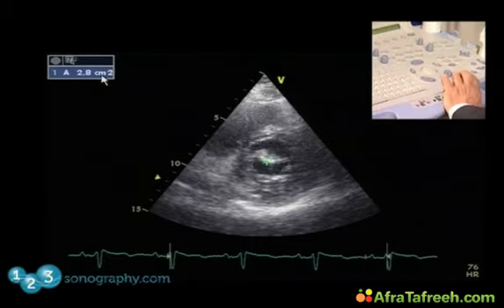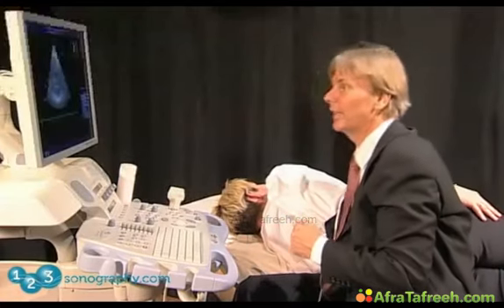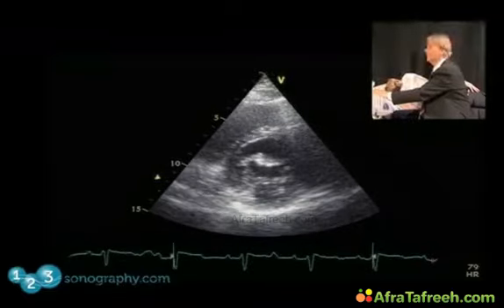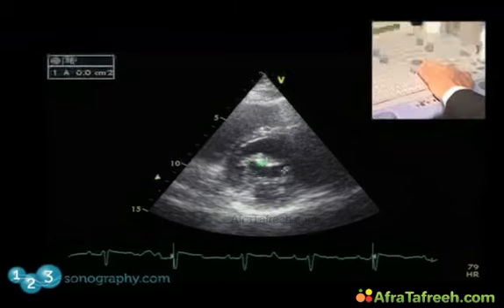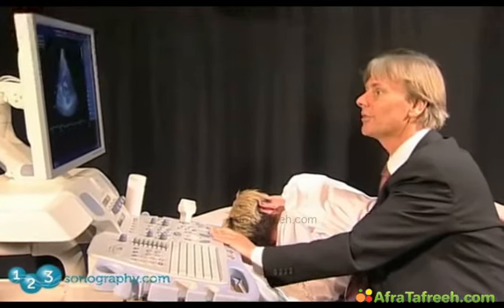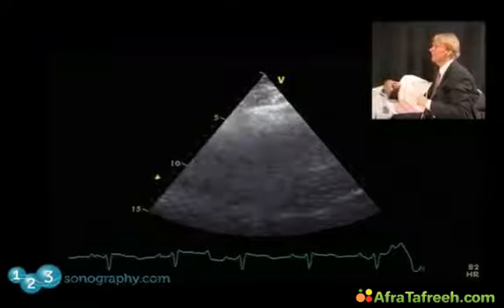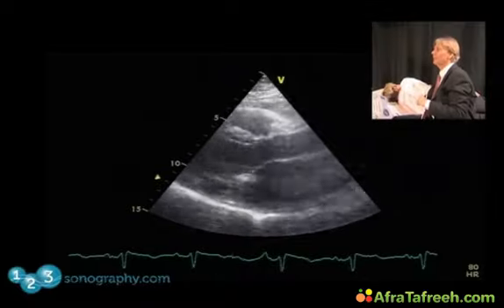And we get 2.8 square centimeters, which is almost a normal opening area. So from the planimetry, we do not have the impression that the patient has significant mitral stenosis. We'll just repeat that to be sure that we really have a good value. And you should actually average a few values to really get a good measurement. And 3 square centimeters again, because this confirms our primary impression that the mitral valve opens quite nicely. This is actually also appreciated when you look at the parasternal long axis view. You see that there's doming, but the valve does open quite nicely.